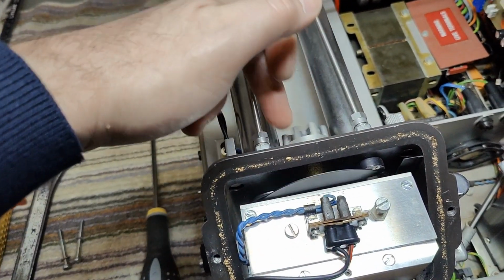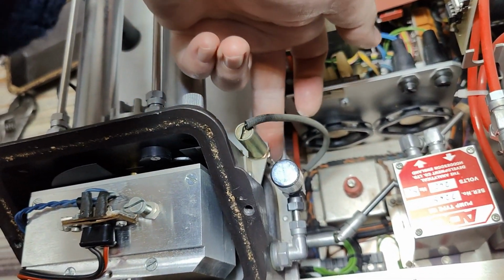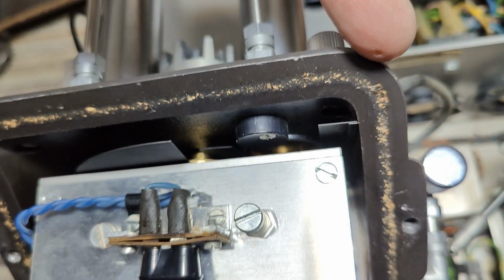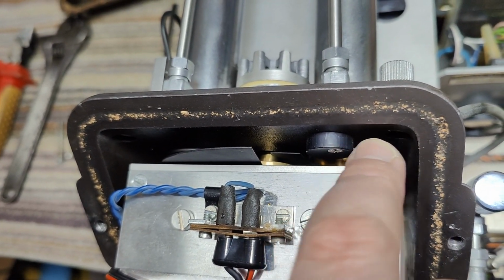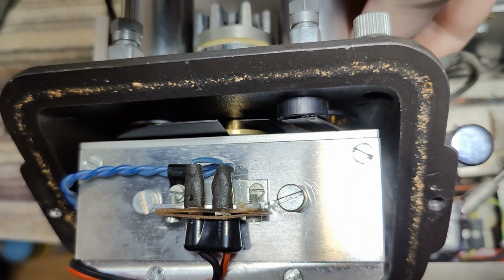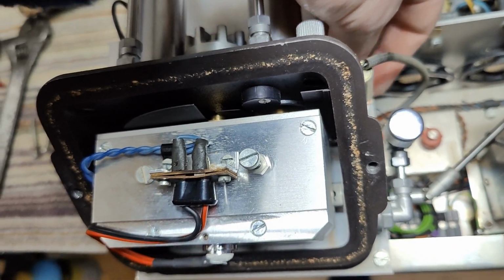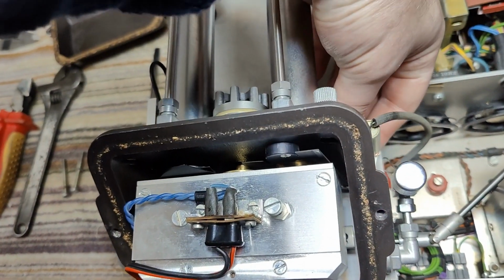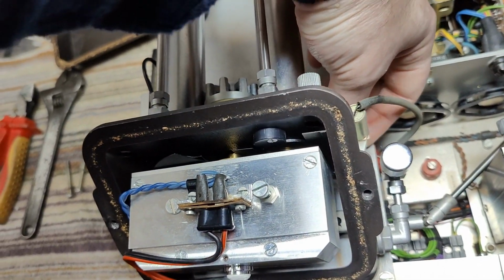And then also I find another cool little thing. Here's a solenoid. So when you activate the solenoid, you move something in between the output from one of them. See, I think it's supposed to move all that way, so it goes in the middle. See, and then you can manipulate. Yeah, okay, now it works. Something here is a little bit bent for some reason. This is maybe why it was thrown out, because you can see the calibrator here is not working. Oh, when you activate it real hard, it can move.